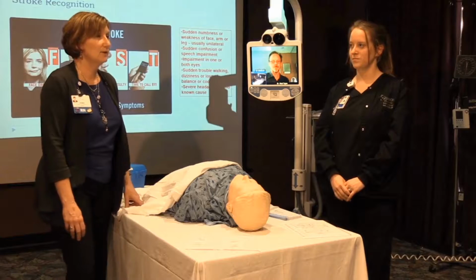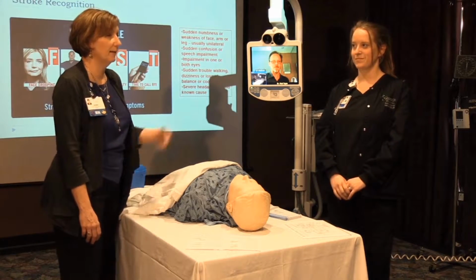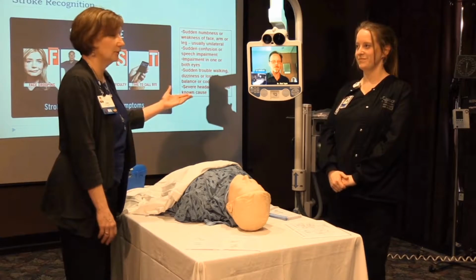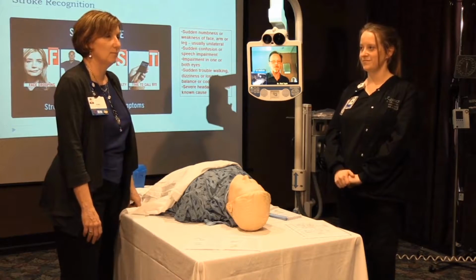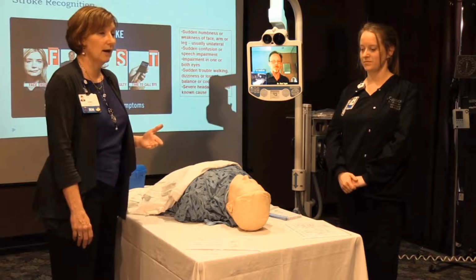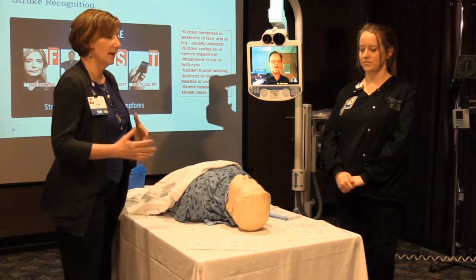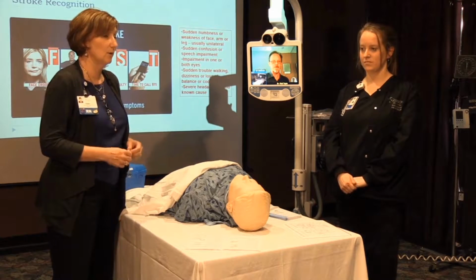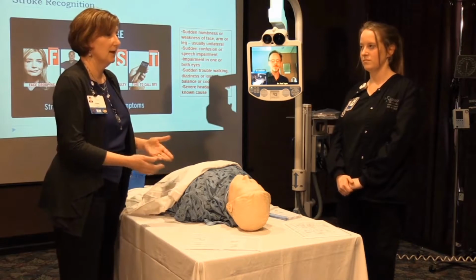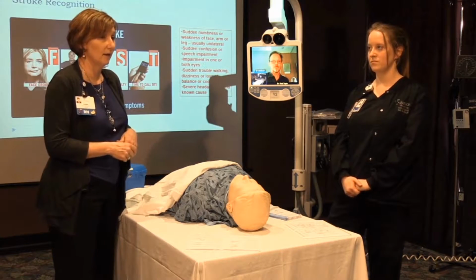Good afternoon. This is Robin Jones, Stroke Program Manager for Mission Health, and I have with me today Kelly Pace, one of our emergency department nurses from Mission, and Dr. Reed Taylor joining us via telehealth from Mission Hospital. What we're going to do right now is go over a typical scenario with telestroke, and so I want to walk through a few teaching points, and then we're going to go into a scenario in which I will be the family member of the patient, Kelly will be the emergency department nurse, and Dr. Taylor will join us via telehealth.